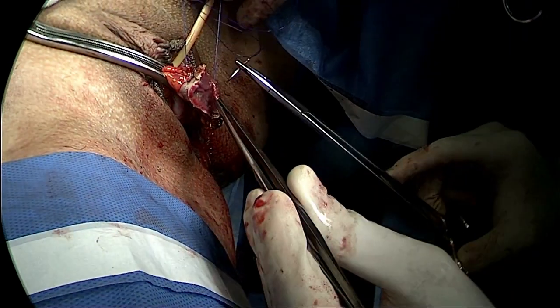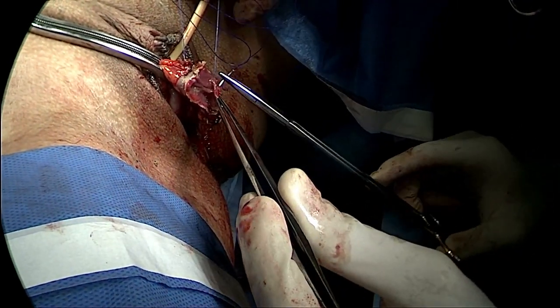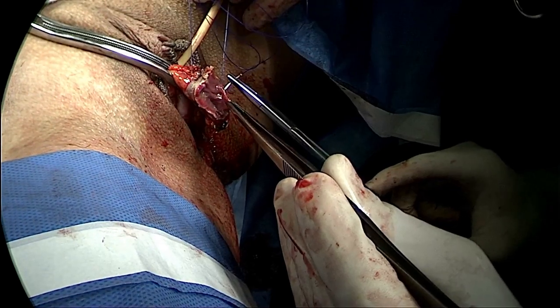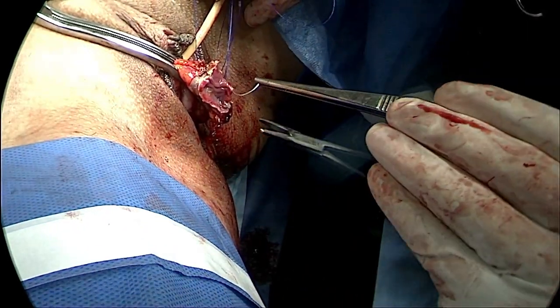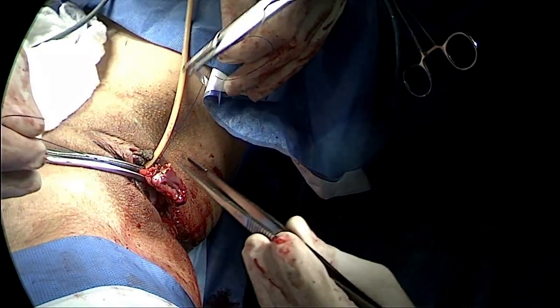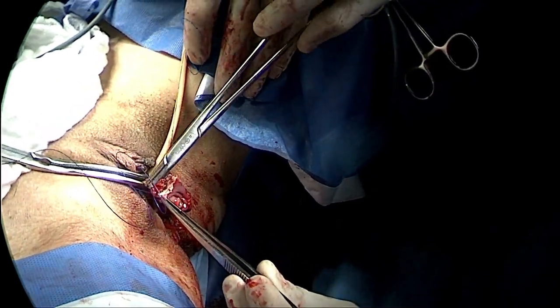The purse-string suture of the proximal limb with polypropylene 2.0 was carried out, and the anvil of the circular stapler, number 28, was positioned.